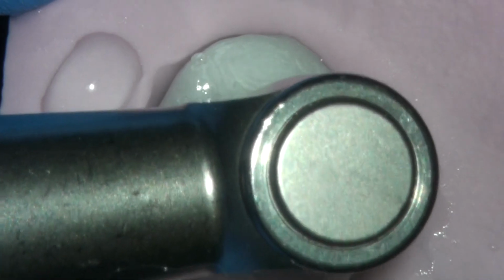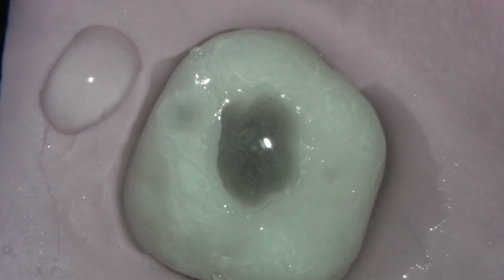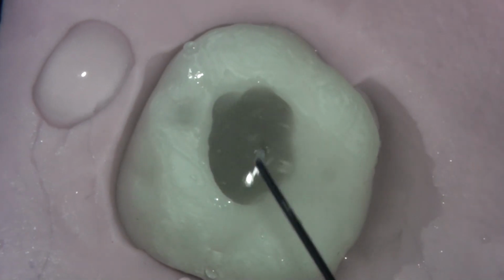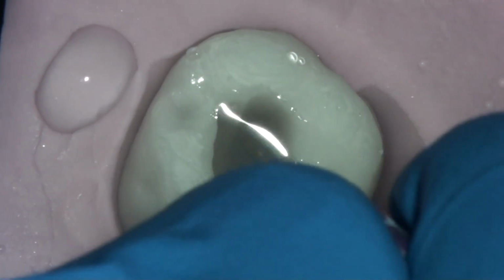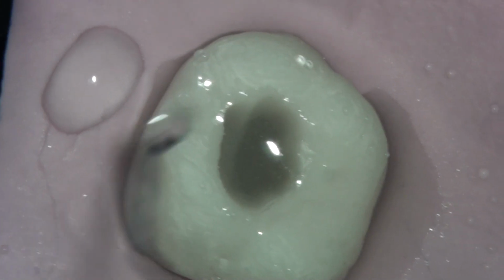And that should go down in one more pass, and you'll feel the instrument engaging and you'll hear it clicking, but that's fine. It's just doing the work that we expect it to do. We of course irrigate, and we don't ignore the step of establishing our apical patency again, and we irrigate again. And so you can see we've done that numerous times.